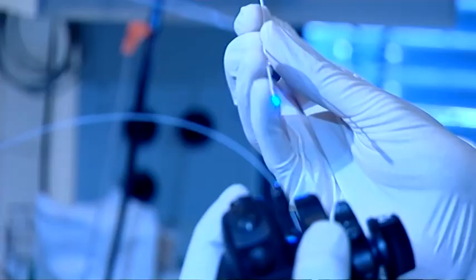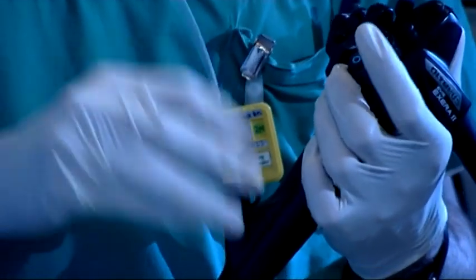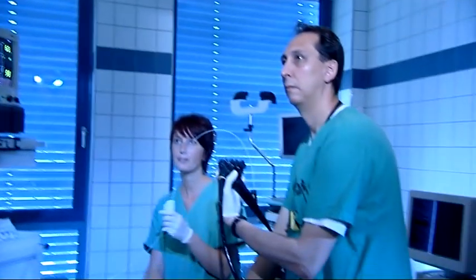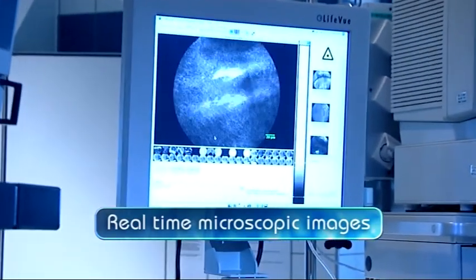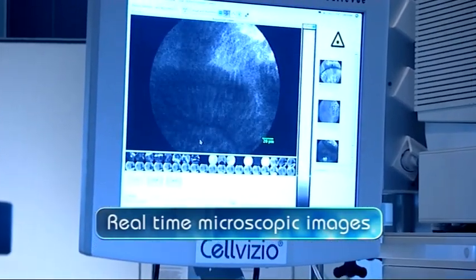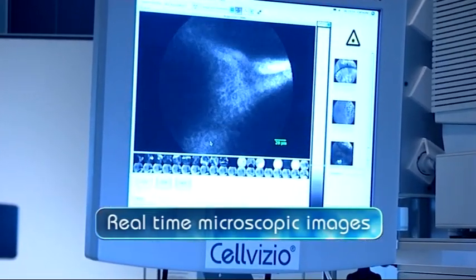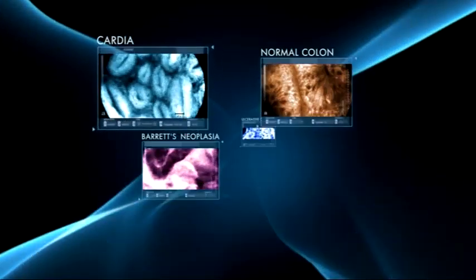How does the Cellvizio system work? The physician performs an endoscopy, and when he encounters a suspicious area, he inserts the confocal mini probe into the operating channel of the endoscope. Simple contact between the tip of the mini probe and the mucosa generates real-time microscopic video images, viewed directly on screen and recordable.